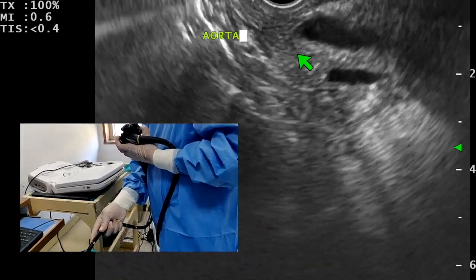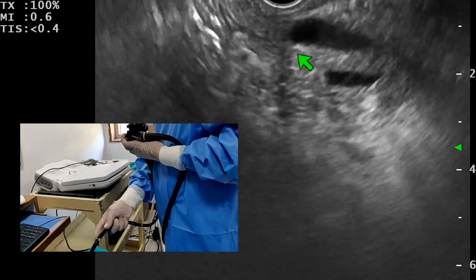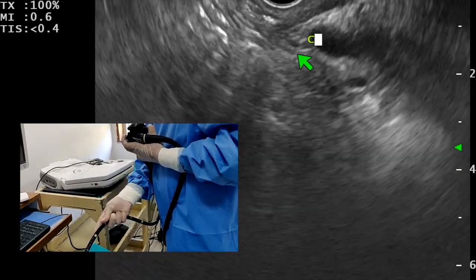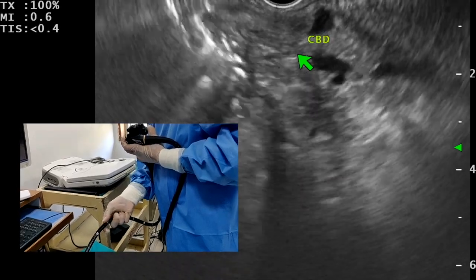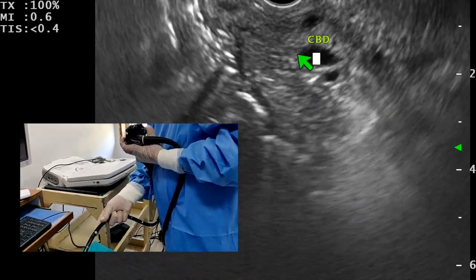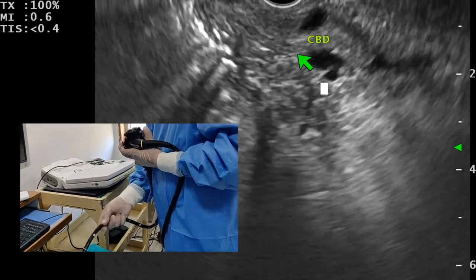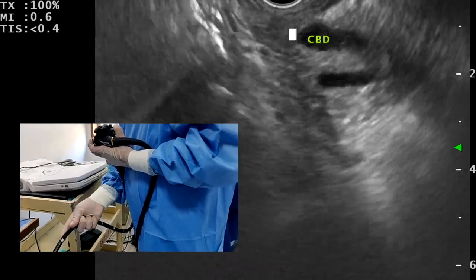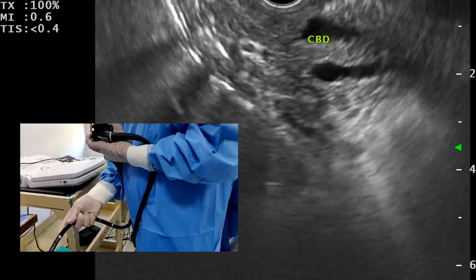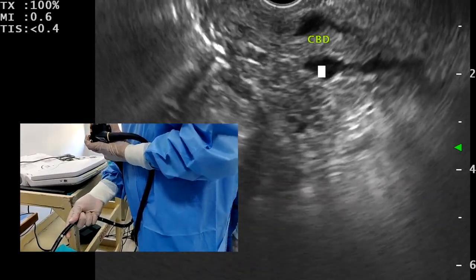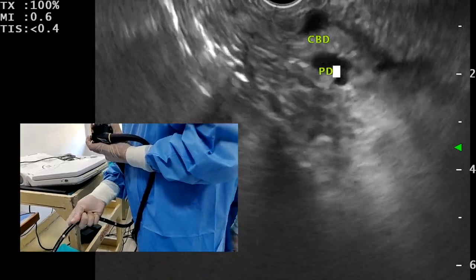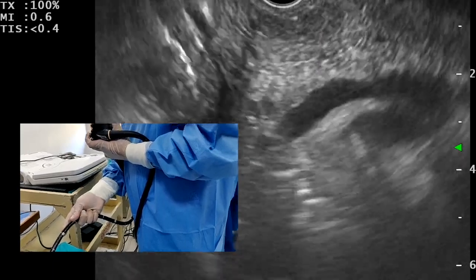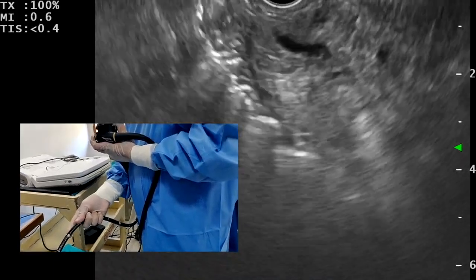From the abdominal aorta, if we give a clockwise torque, we can see two anechoic structures. The structure which is close to the probe is the distal part of the common bile duct. The duct is running from right to left, and the ampulla will be on the left side of the duct. Below the CBD we can see another duct which is the pancreatic duct. From the CBD, a subtle clockwise torque shows the PD, and an anti-clockwise torque brings back the CBD.